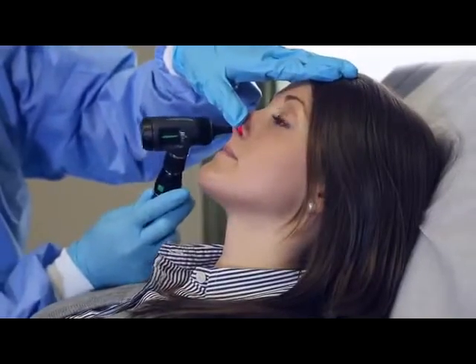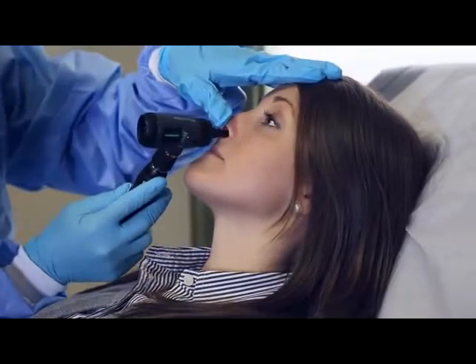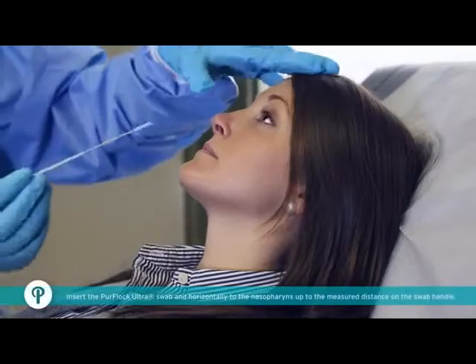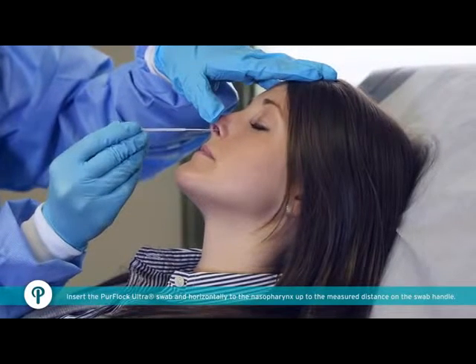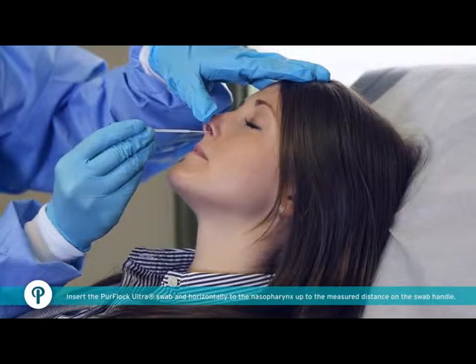Tilt the patient's head backwards slightly to straighten the nasal passage from the front of the nose to the nasopharynx, to make insertion of the swab easier. Insert the PureFlock Ultra swab into one nostril straight back, not upwards, and horizontally to the nasopharynx up to the measured distance on the swab handle.